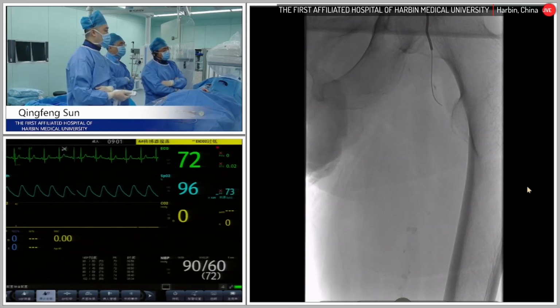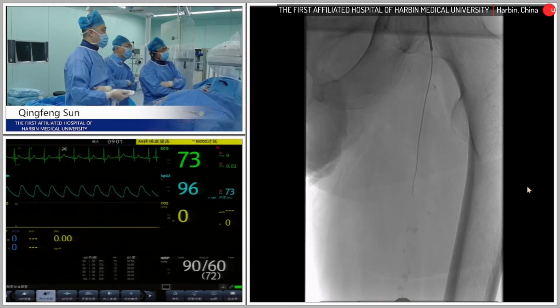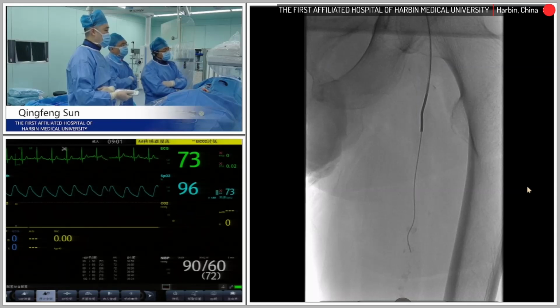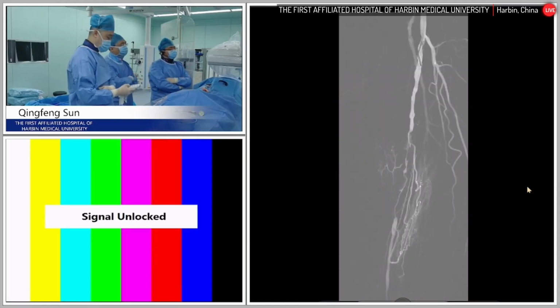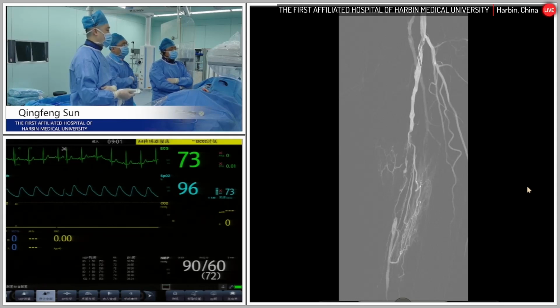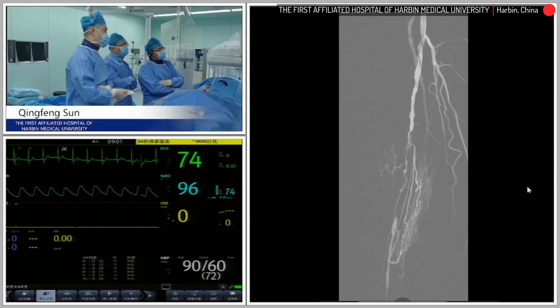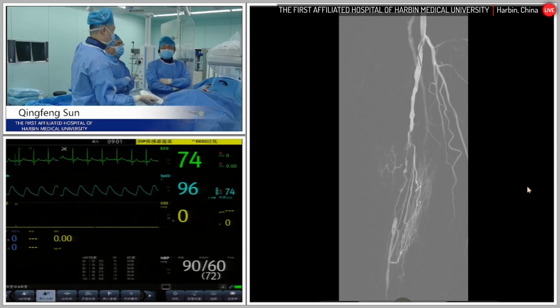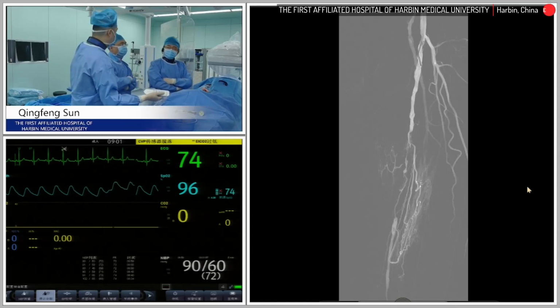After that, we are using the guide wire going to the SFA. And here we got some resistance. You can also see the calcification, which is the disease there. We do put some effort into trying to get past the disease, because although the collaterals are pretty good, a healthy SFA with more outflow is good for the stent. Yes.